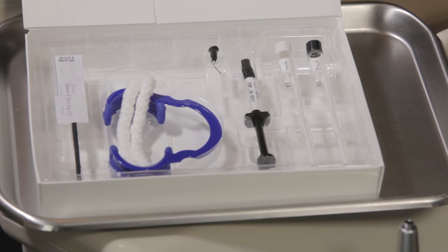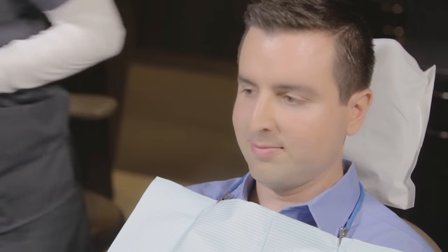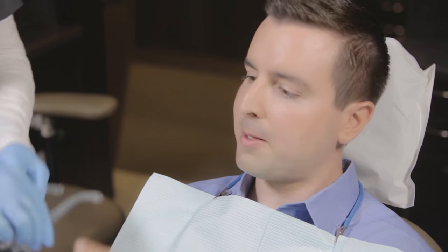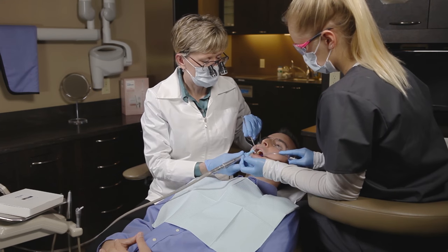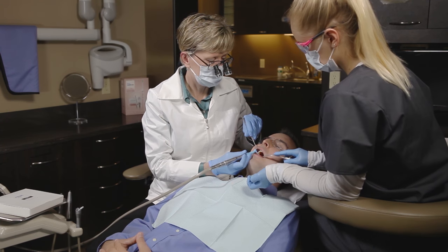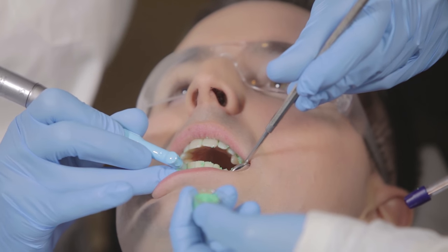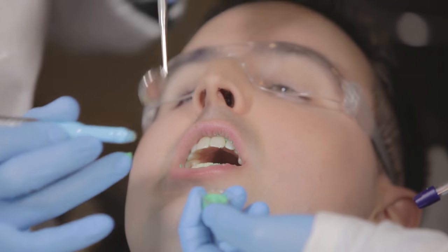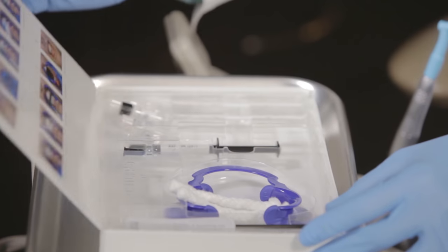Everything you need for a Quick Pro treatment is in the kit. To start the treatment, make sure the patient's teeth are free from moderate to heavy plaque and calculus buildup. Ideally, Quick Pro should be applied immediately after polishing with a standard prophy paste, making it an easy addition to a regularly scheduled prophy appointment. If you are applying a fluoride varnish, the Quick Pro whitening varnish should be applied first, and the fluoride should be applied only to non-treated tooth surfaces.